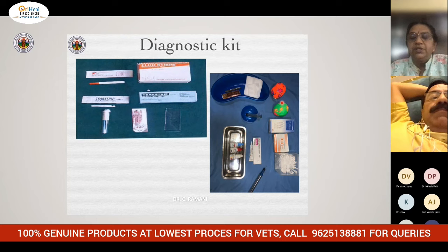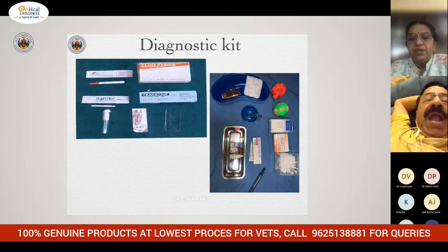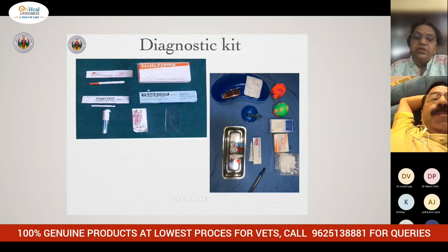Cotton balls can be kept as a ready thing for examination of the vision. And you also have some eye drops, antibiotic. This is the proparacaine, and these are all antibiotics. And this is a dilator, and the blue thing is actually an antibiotic. I do not know whether you know that the cap actually indicates what type of medicine it is. Okay, we will come to that in ocular therapeutics. Then you have the strips, and you have some earbuds.